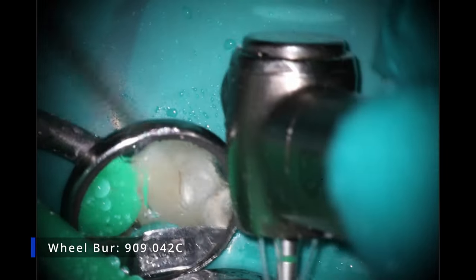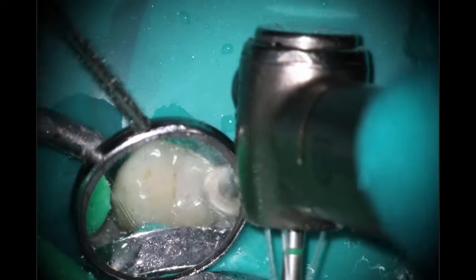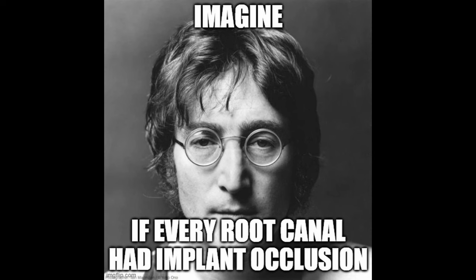Starting off here, we're going to be adjusting the occlusion. A lot of dentists will use the existing design of the crown when they're making their CAD CAM, and I've found that it's nice to kind of soften those cusps a little bit. Because, let's be real, if every root canal tooth did have that softened occlusion, we'd have far less issues.